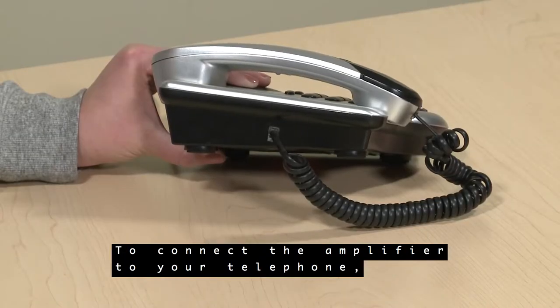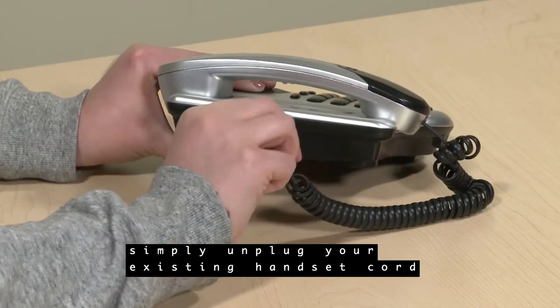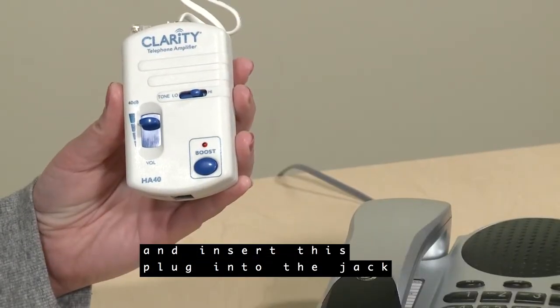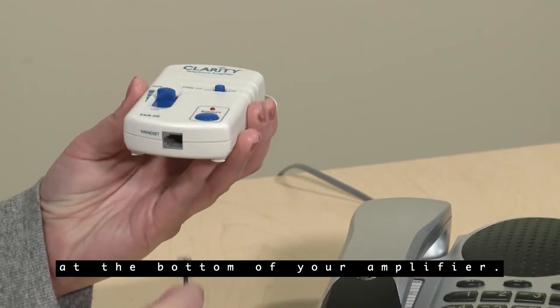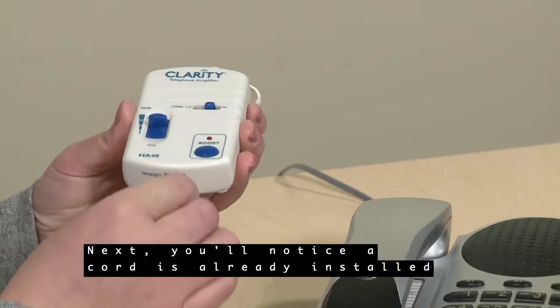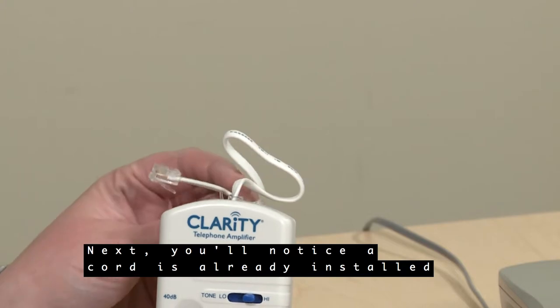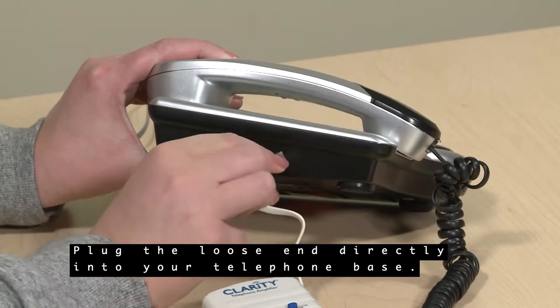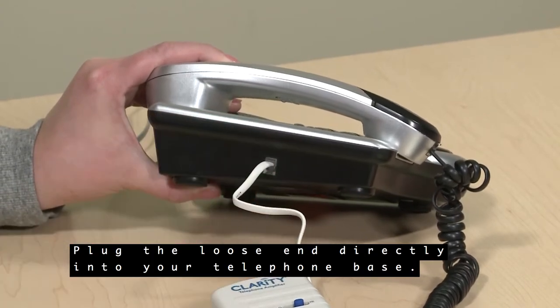To connect the amplifier to your telephone, simply unplug your existing handset cord from the base of your telephone and insert this plug into the jack at the bottom of your amplifier. Next, you'll notice a cord is already installed in the top of your amplifier for your convenience. Plug the loose end directly into your telephone base.